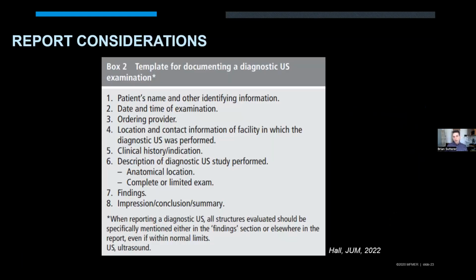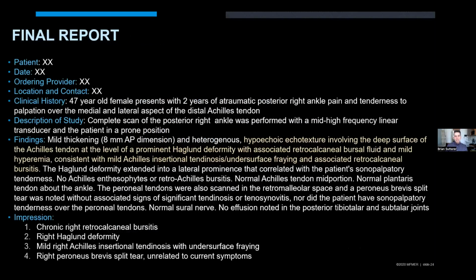Moving on to our report now, I think this is important to highlight, this article by Dr. Hall that was published in JUM earlier this year, with some guidance and recommendations for documentation and terminology for diagnostic ultrasound. And so I think it's important to try and get our reports to match what's being recommended now.